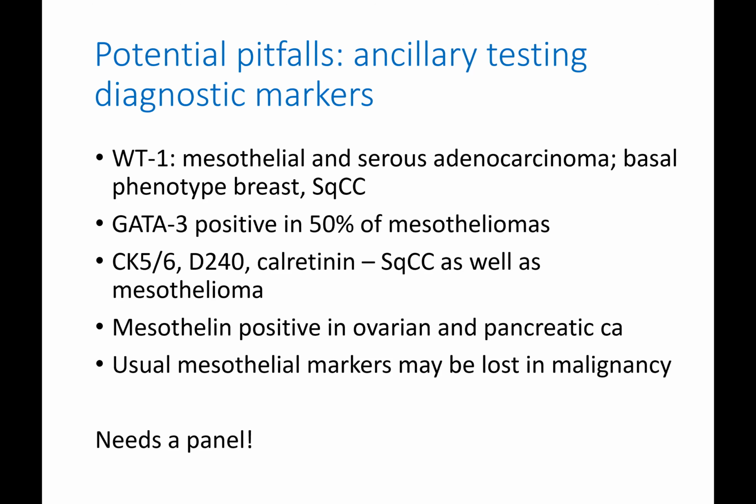GATA3, which we use commonly for breast carcinoma, is also positive in up to 50% of mesotheliomas. And some of the mesothelial markers, CK56, D240, calretinin, can also be positive in squamous cell carcinoma. Mesothelin is positive in ovarian and pancreatic carcinoma as well as mesothelial cells. And importantly, with mesothelioma, some of the usual mesothelial markers may be lost in malignancy, and therefore it makes sense to have a panel when undertaking immunocytochemistry.